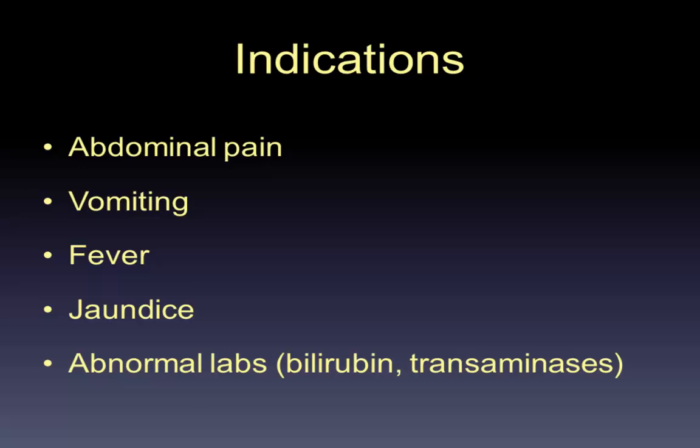Another good reason to do ultrasound of the gallbladder is to, again, rule in or out something and focus your differential and your workup a little bit more.